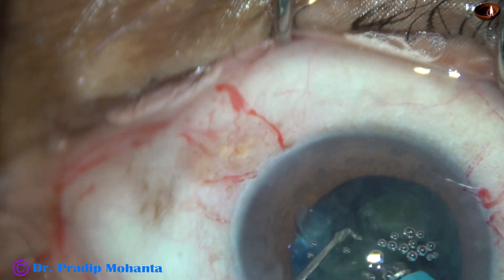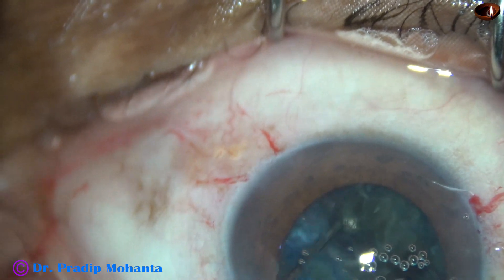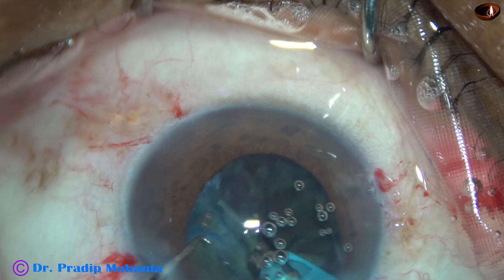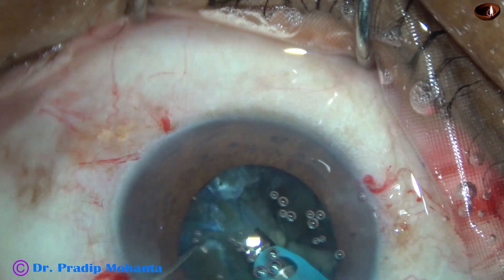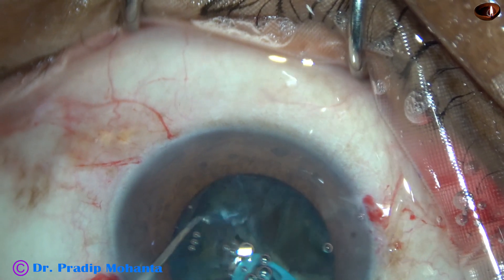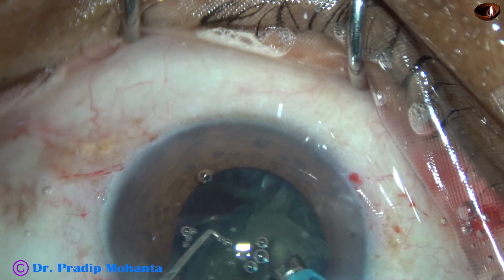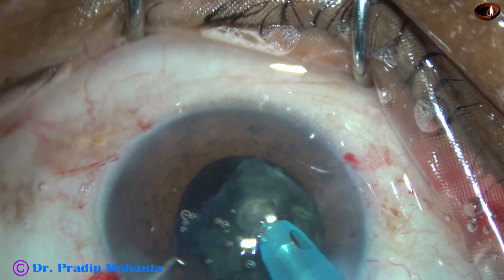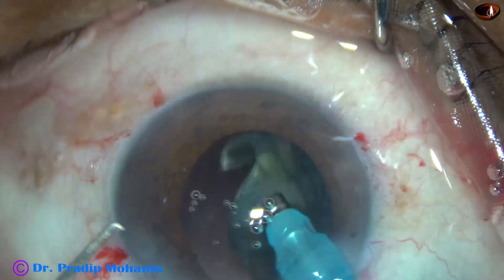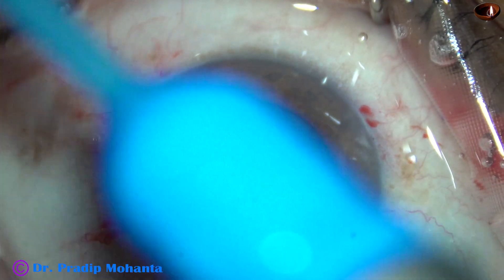Very slowly I am managing the nucleus. I still find some tendency of the anterior chamber to become unstable. But see the air bubbles — they are not moving, so there is not much fluid turbulence. And I am far below the corneal endothelium. I could get the left half of the nucleus complex and it came out nicely.